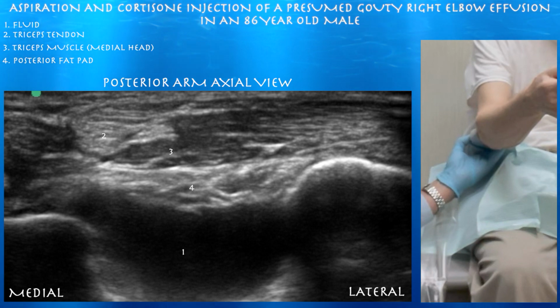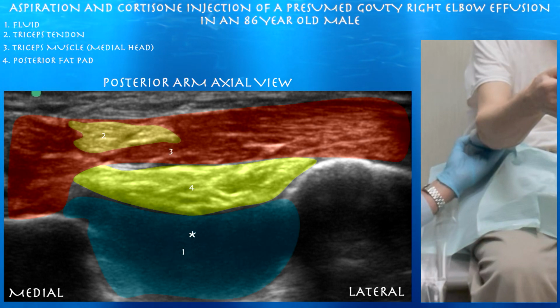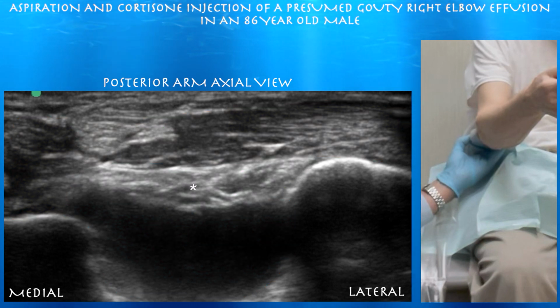Here we're looking at the posterior elbow, essentially the olecranon fossa, which has a pretty large effusion. You can see the posterior fat pad. It's pushed up posteriorly towards the triceps muscle.